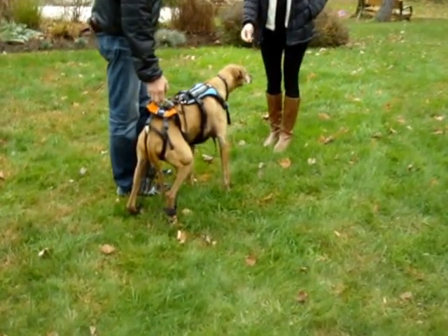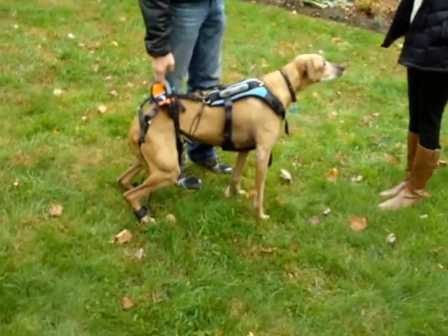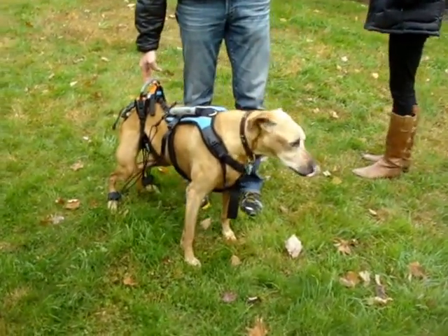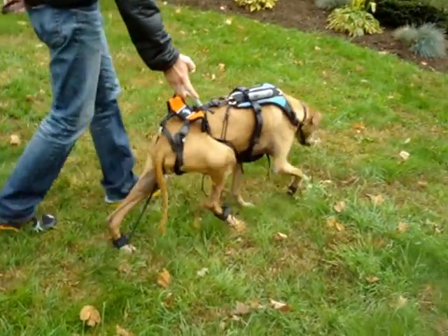The other idea is to see how she can do it swimming, and to work with her therapeutic practitioners at her hydrotherapy center to get feedback on the use of these legs in the pool, so that we're not just doing the up and down — we're getting a more fluent range of motion.